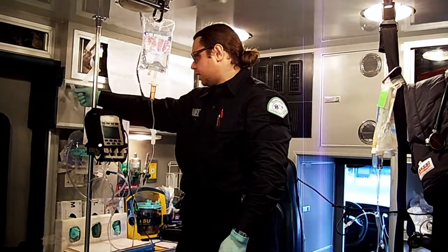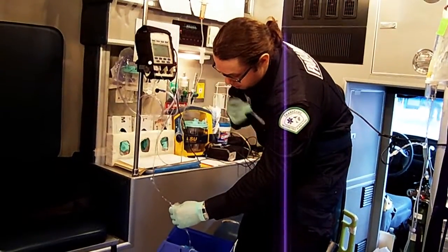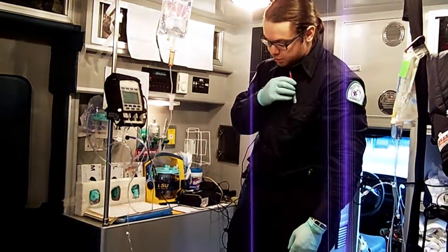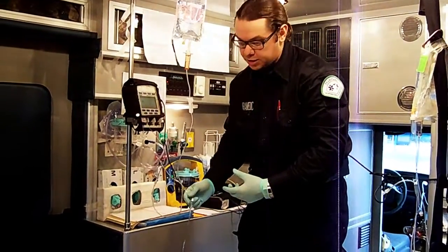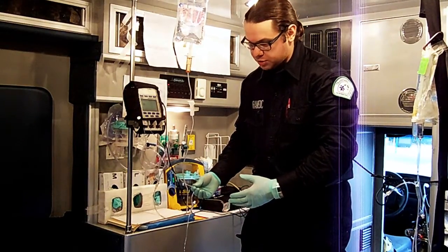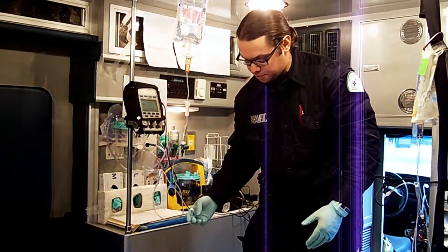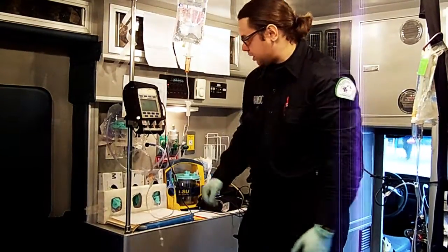After labeling the cassette, I take a piece of tape and put it on the IV line as well, writing NS. The reason I label the line is that when you have several lines and multiple drugs going at the same time, you really want to know which is which — in case you need to administer another drug and check compatibility, or if a line triggers an air sensor alarm or blockage and you need to know exactly which line to troubleshoot. If you have 5 or 6 lines going with no labels, you'll be struggling.